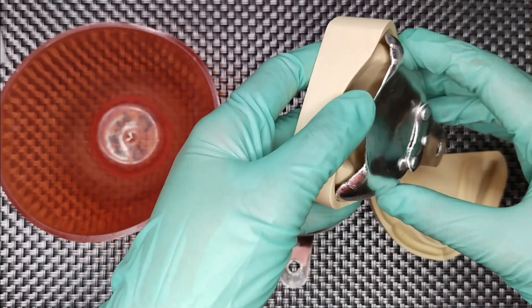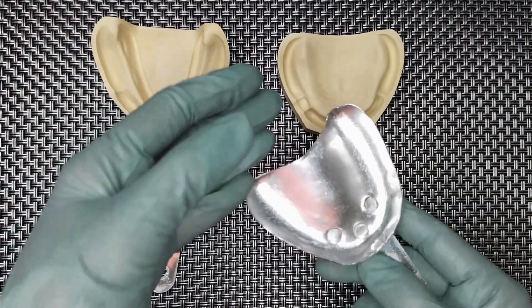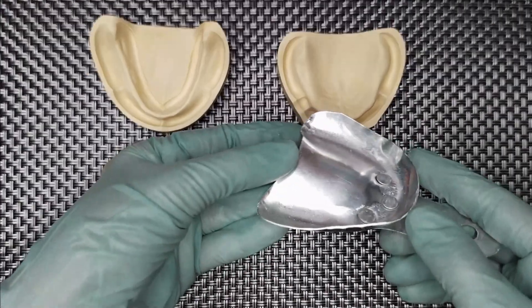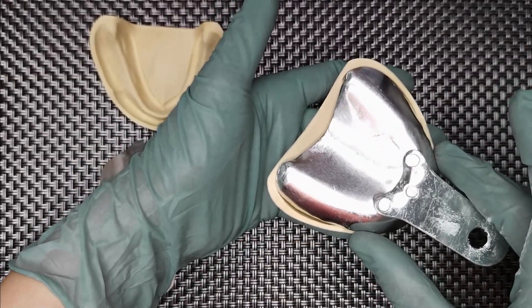A little bit extended, so we can trim the areas. Now this is the cut and shaped maxillary stock tray. Note the extension of the tray.